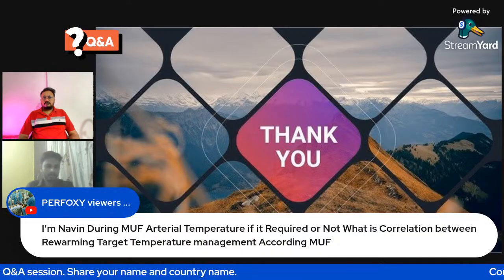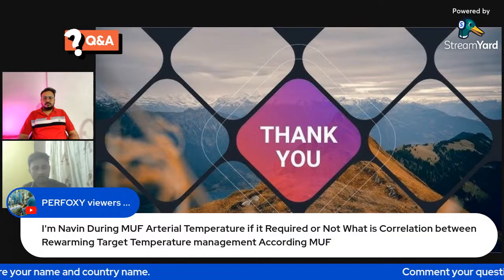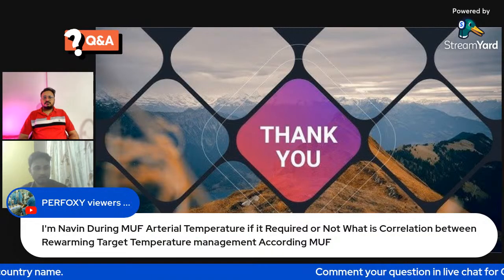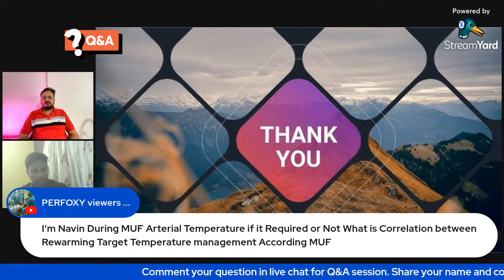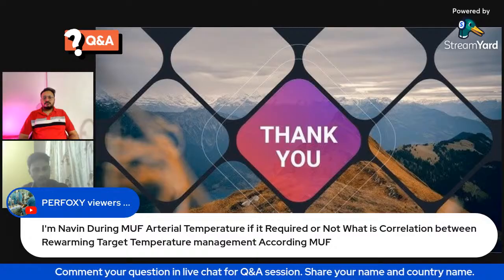Sir, we do MUF only after CPB. Whatever rewarmed blood comes, it goes to the ultrafiltration only.